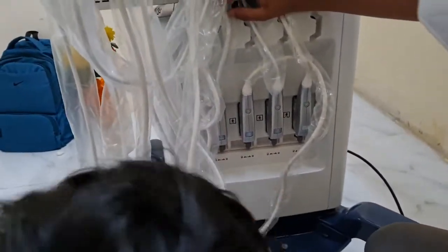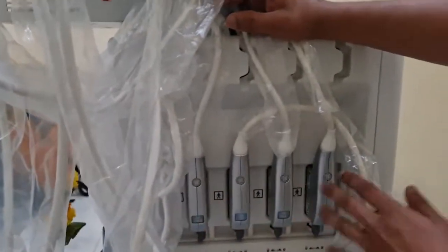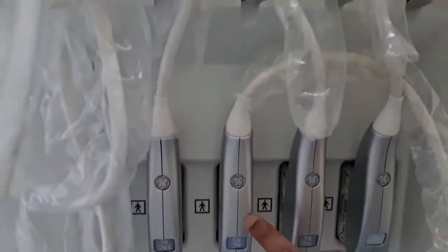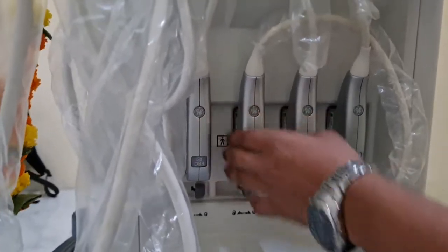These are the probes. You can connect them anywhere you want. Like this probe, if you want it here, you can connect it here. This probe you want here, you can connect it here. Just slot it into the connector and lock it.